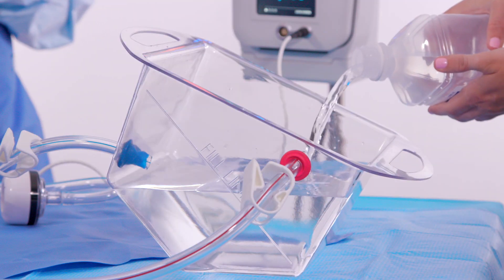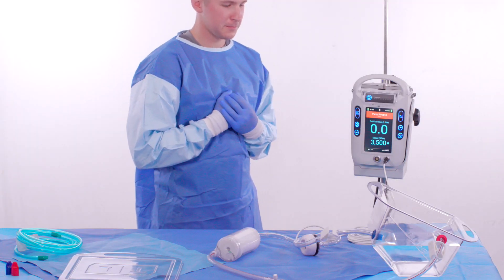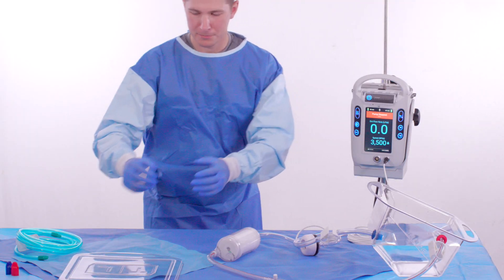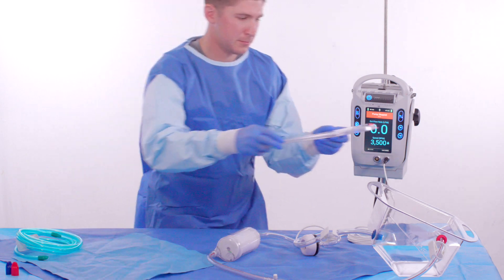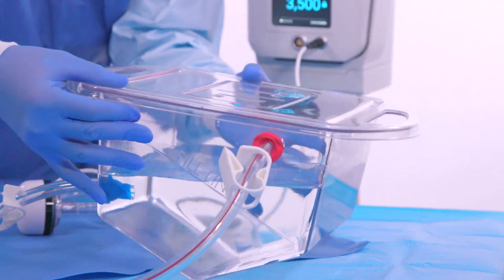The non-sterile operator fills the basin corner to corner with approximately four thousand milliliters of saline. Once this is complete, the sterile operator places the lid back on the basin and tilts the basin to the prime-ready position to gravity prime the pump.